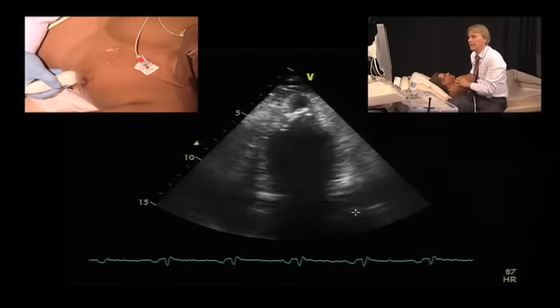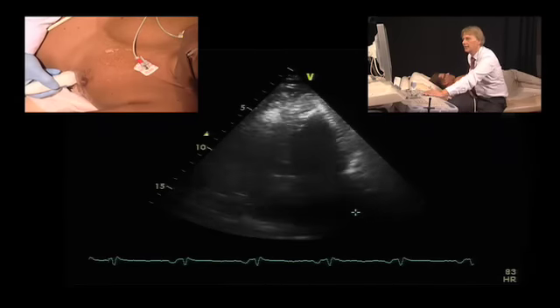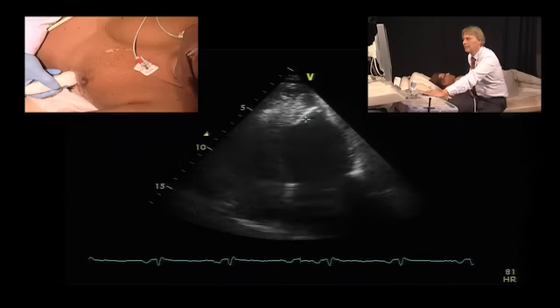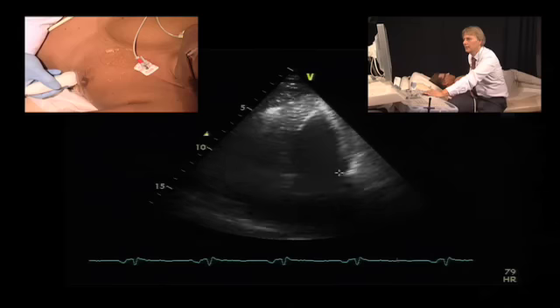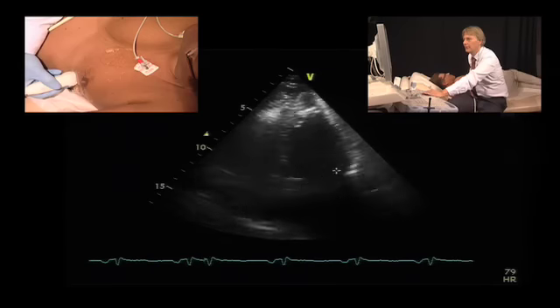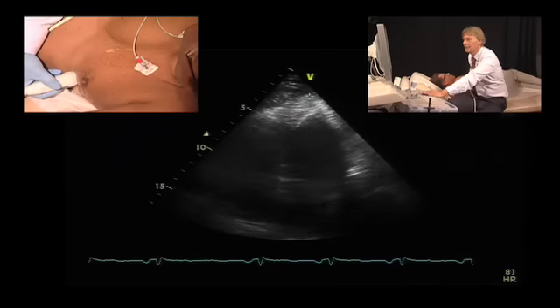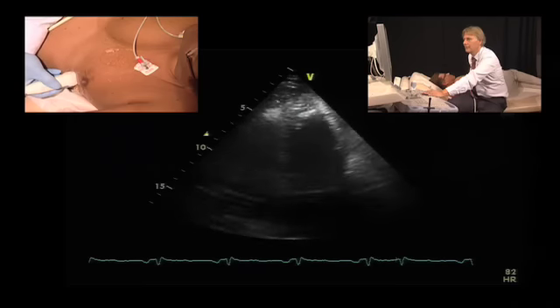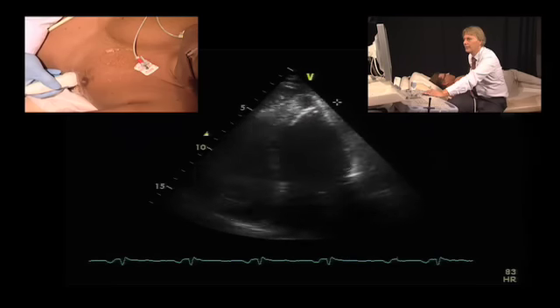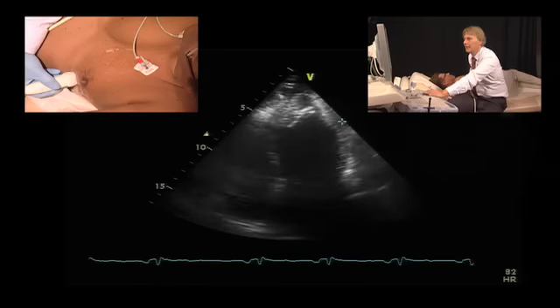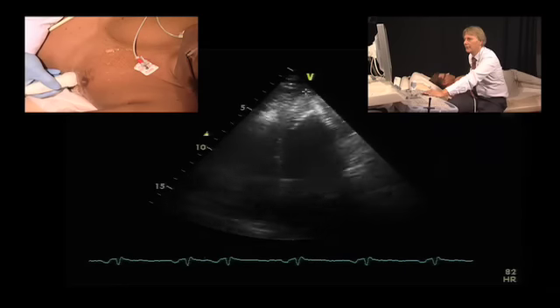Let's take a look at the apex. You see the image quality is not very good, which is easily explained because we have fibrosis and also an infiltrate here in the apex, so that we don't get very good image quality down here. But we can nicely see that there actually is an infiltrate here in the apex — very echolucent structures which fill the apex, and which are very unlikely to be a thrombus simply because we have a normal contraction pattern here in the apex.